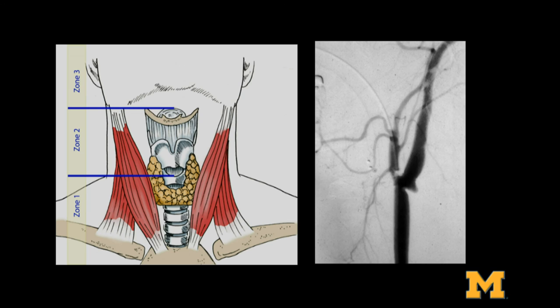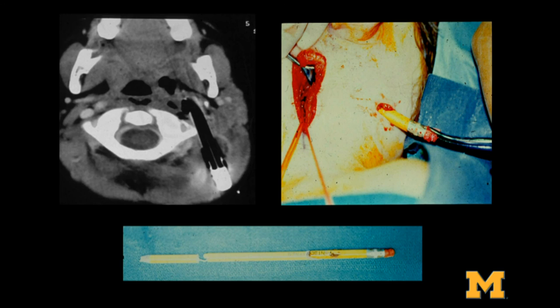So here's an example. Again, what's that worst history you could have when you got a young boy playing with his sister, right? So they were playing together, right? Johnny was playing with Jill. And you know how things don't go well after a while, right? So they were playing with a pencil, and all of a sudden, mom heard Johnny go, ouch, and start crying. Well, you did a plain film, normal or abnormal, right? And unfortunately, there's a CT scan, right? Abnormal, and there's a little pencil.